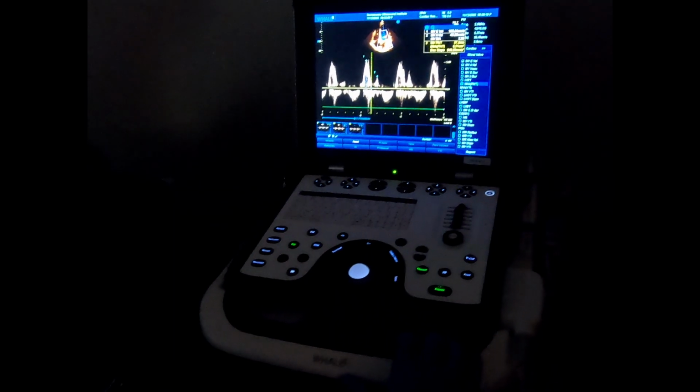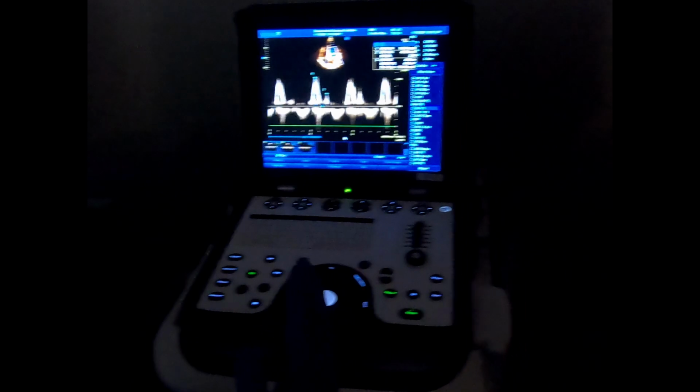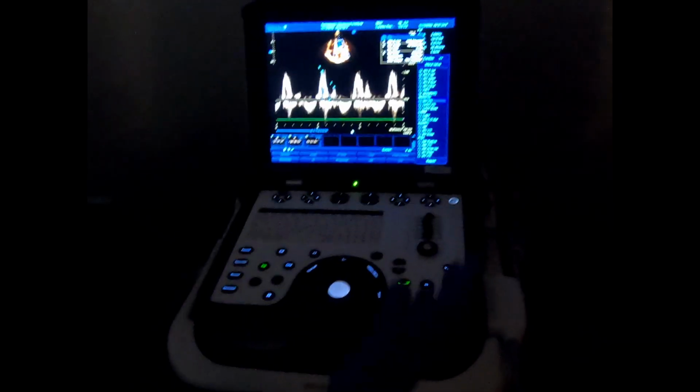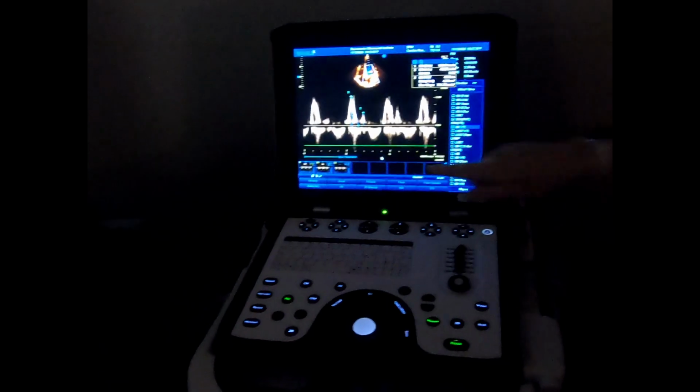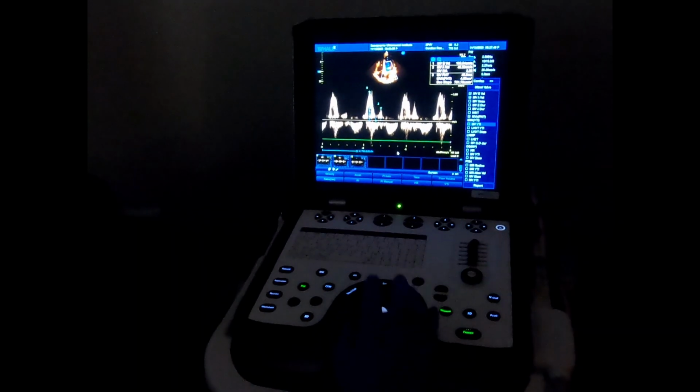So that's deceleration. Did you already explain why you picked the first P? I mean, continuously you would get confused, and instead use something else. Does it let you go down there and click it? Because it doesn't look highlighted. Yeah, it will allow you to measure.